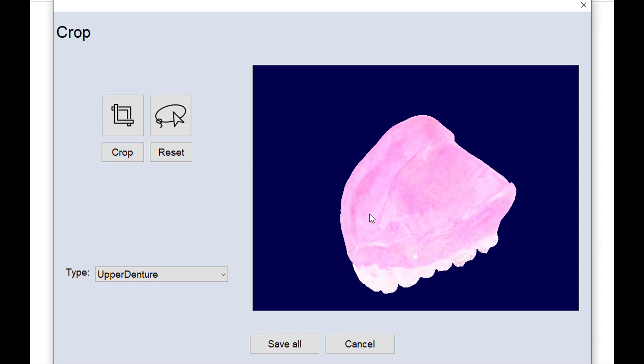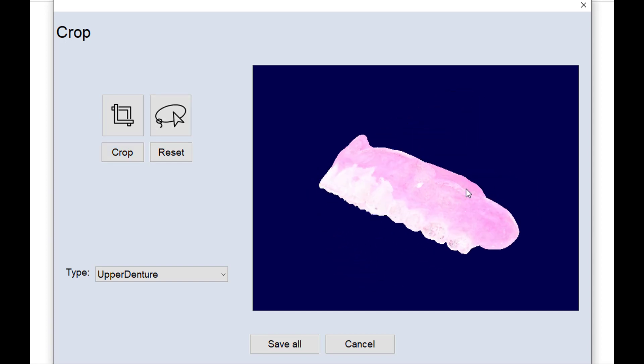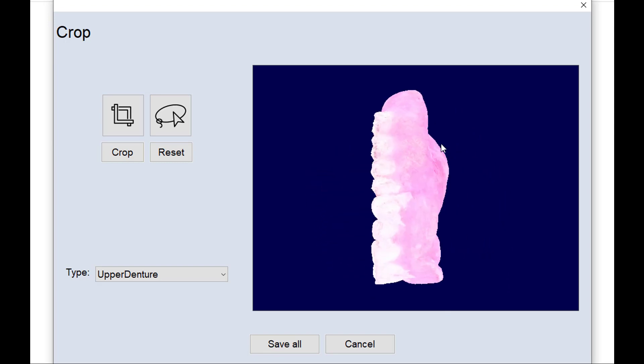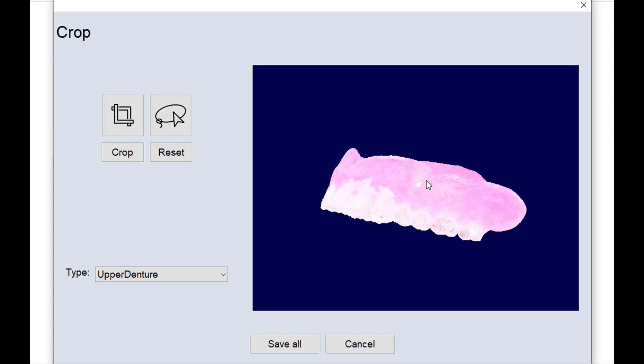And that will get rid of any little bits that are unattached to the model. And with that done, it looks like this is finished. So I'll save that.